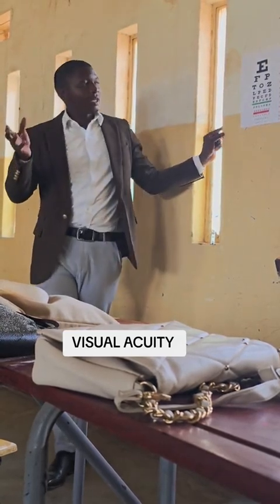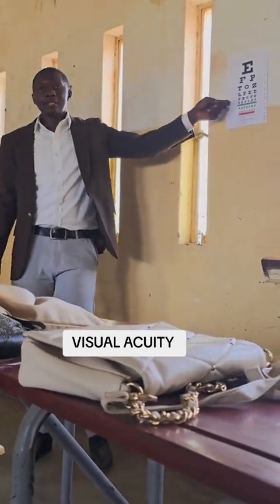So that is the only tricky part on recording using the Snellen's chart.